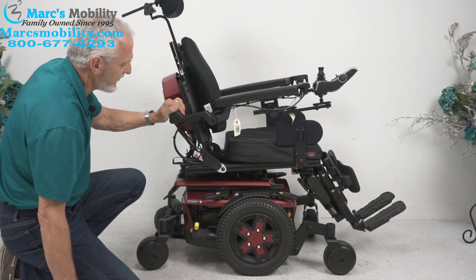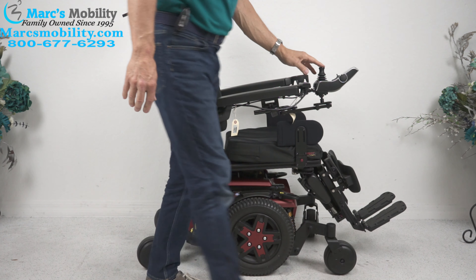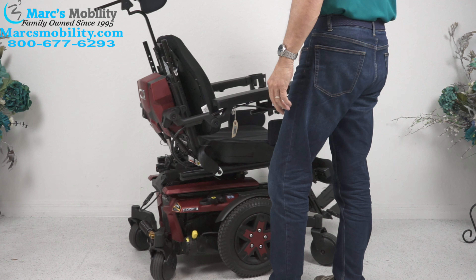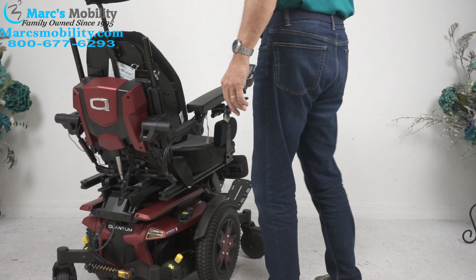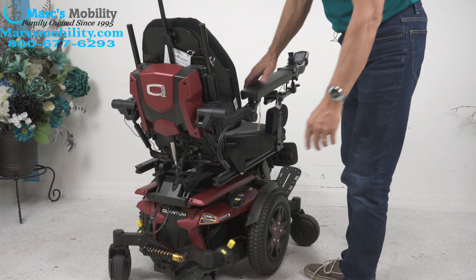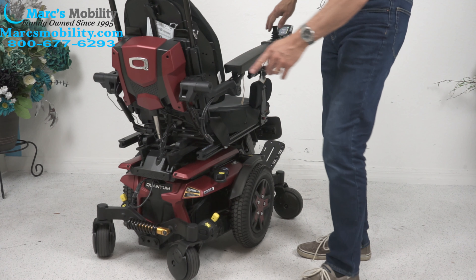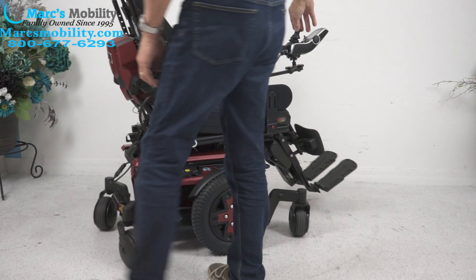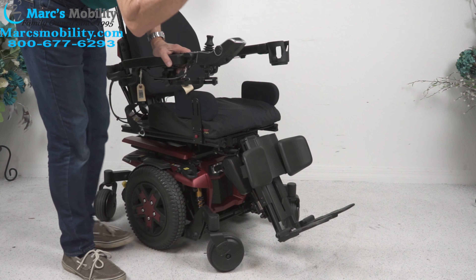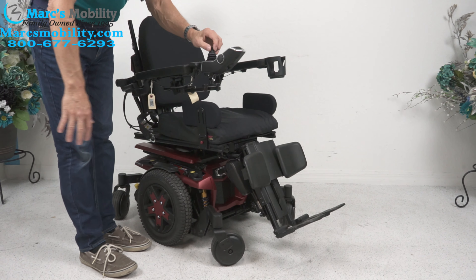This chair has phenomenal suspension. Let me show you the rear suspension first — look at that suspension back here. Nice heavy-duty suspension. There's one in the back and two in the front, so there are three heavy-duty shocks total. This is why this chair has such great suspension when you're outside.